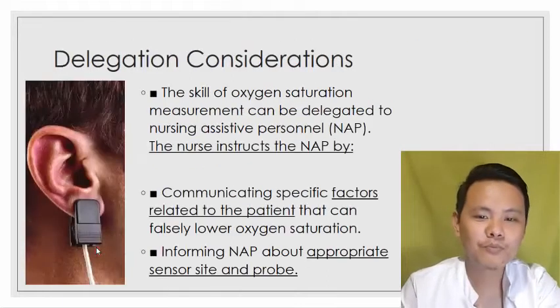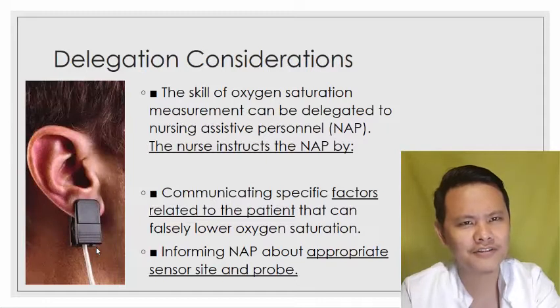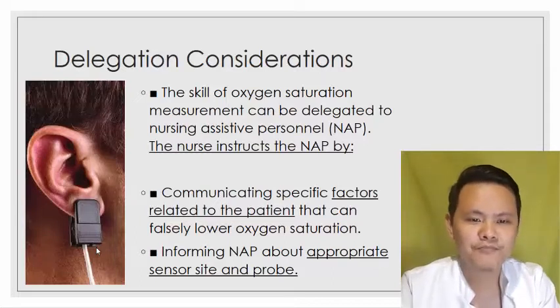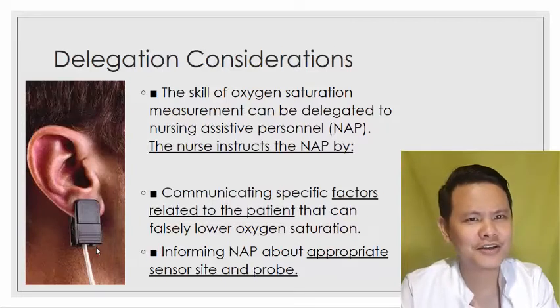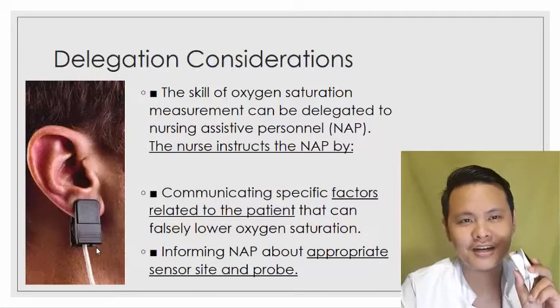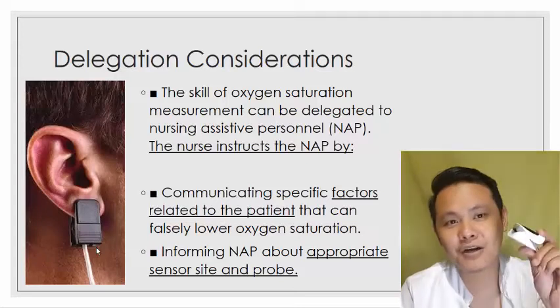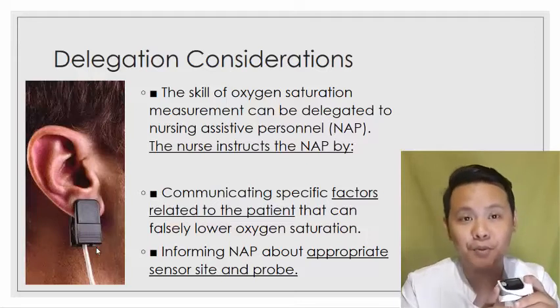Okay, next, we have the delegation consideration. Can we delegate the measurement of the oxygen saturation to an NAP or the nurse assisted personnel, or in the Philippines we call it the nursing aide? Pwede kaya tayong mag-delegate sa kanila? Pwede kaya sila ang mag-measure ng oxygen saturation ng ating client? Answer is yes. Pwede tayong mag-delegate sa kanila. Remember, this one is non-invasive. Since this is a non-invasive procedure, pwede.